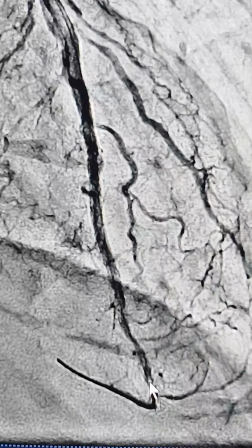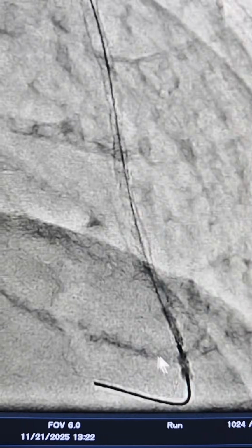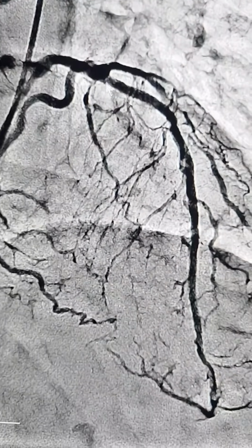So now there is this apical part, there is still a tight narrowing there. Now that you've committed, I'm going to use 1.5 to open this up, and this opens up at last. So now the result is pretty good.